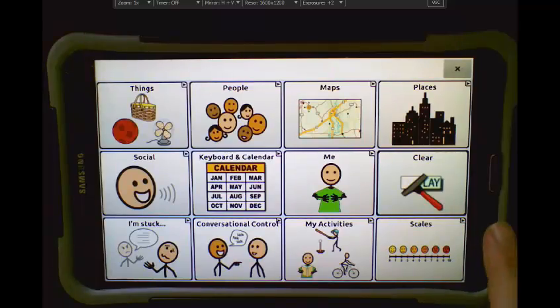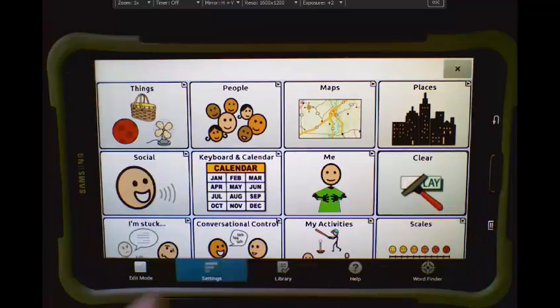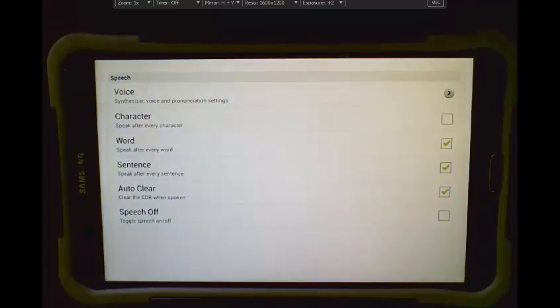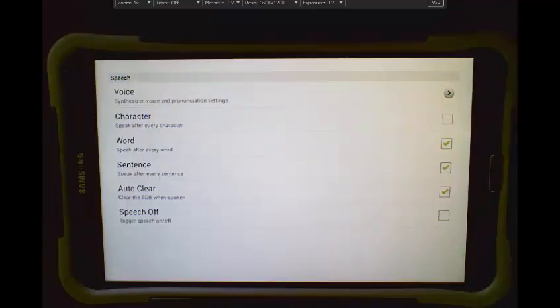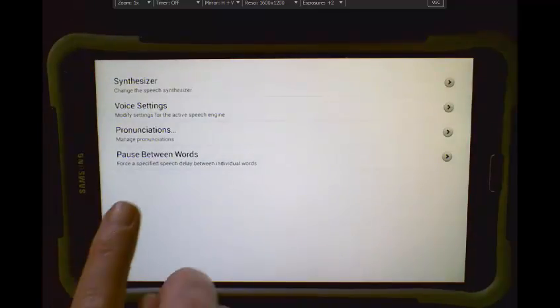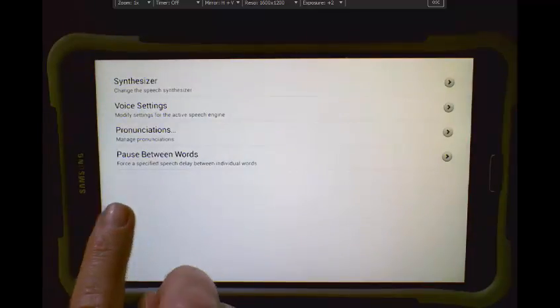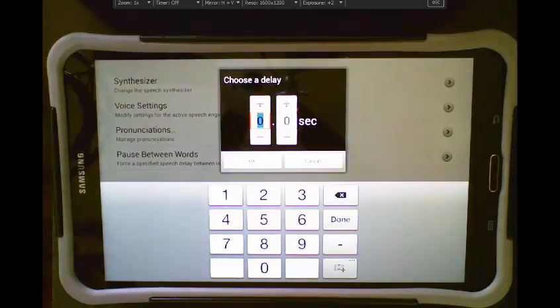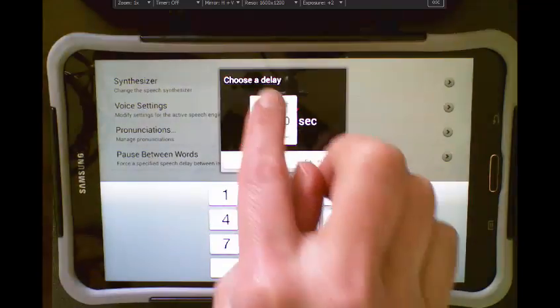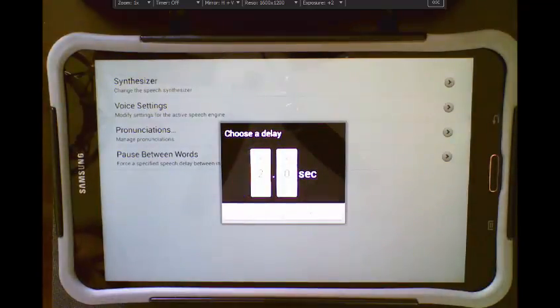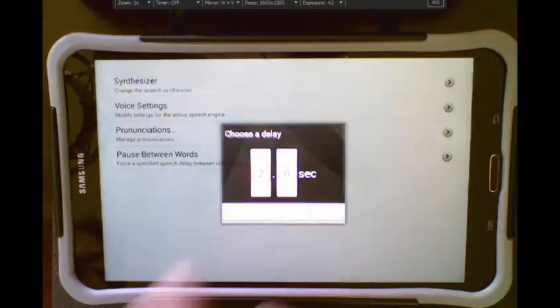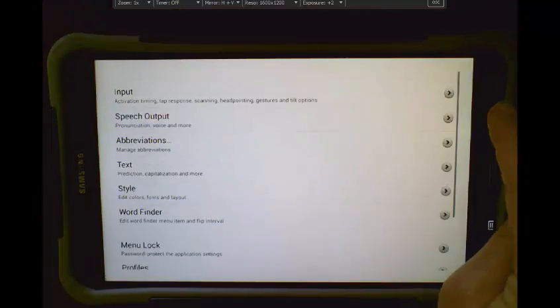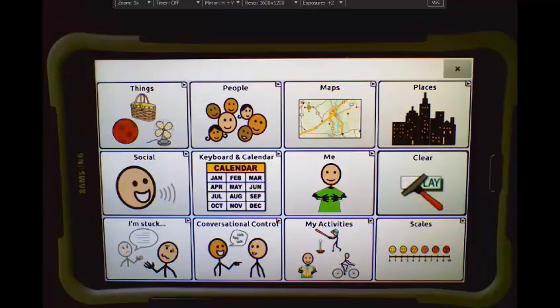Tap Menu, Settings, Speech Output, Voice, and we see the option for pause between words. I tap that option, and I now can set between one and three seconds between words. I'm going to go ahead and bring it to two, tap OK, and let's go back and try it out.